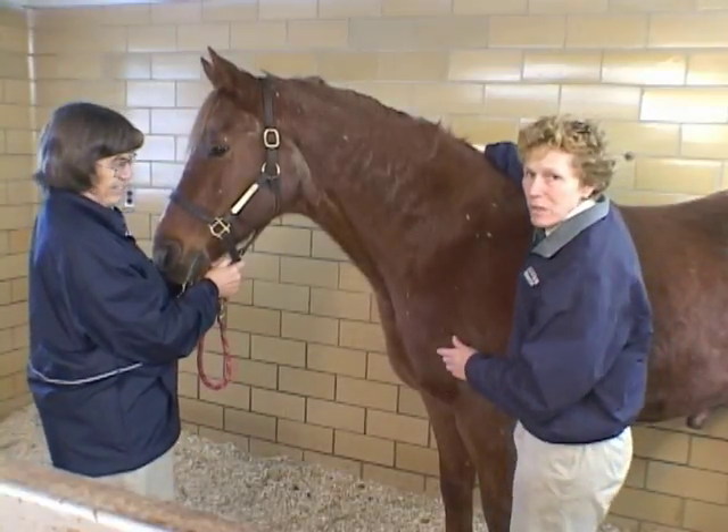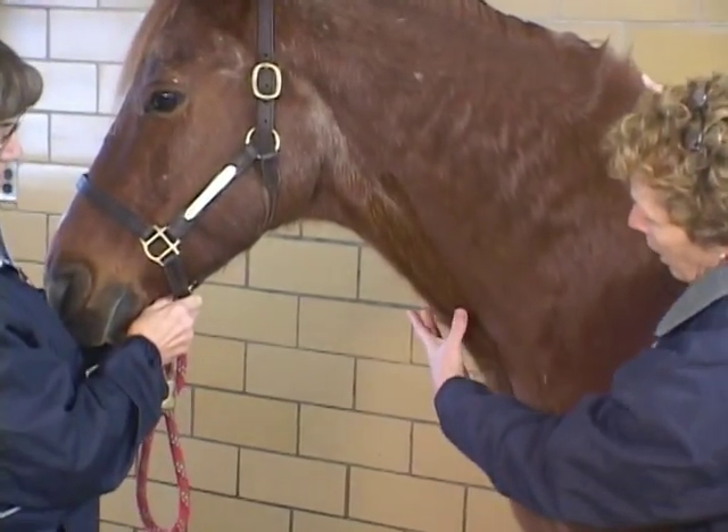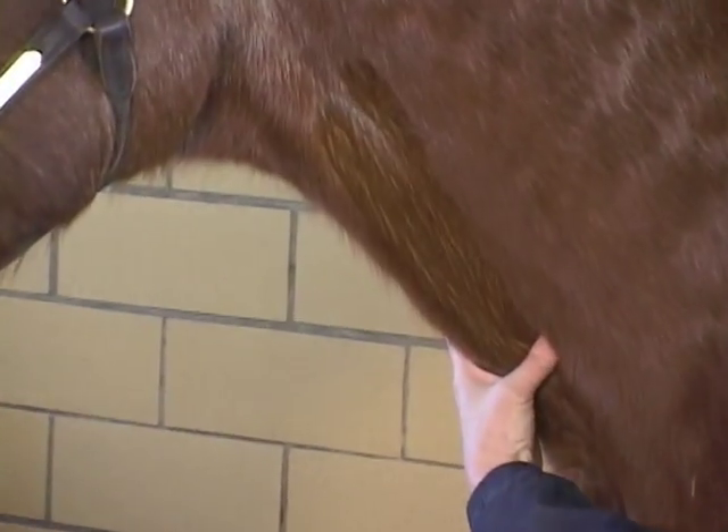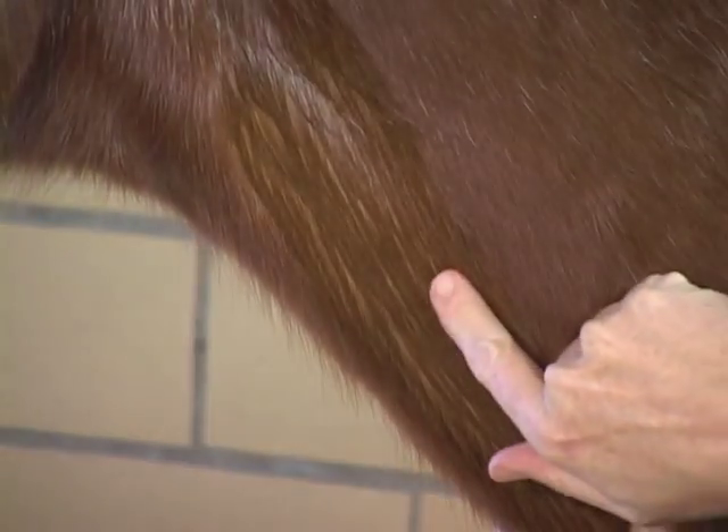We've moved Red around so you can see the unclipped side to visualize the jugular. Because he has a nice thick winter coat, we've gone ahead and put a little alcohol on his neck so that when the vein pops up, you can see it a little bit better. I'm holding it off and you can see it coming up — see the little wave as I bounce my finger on it? One of the tricks in practice is to never panic; just wait because the blood will fill the vein and you will get a good view. It's better to wait and stick where you're sure than to just randomly stick a needle into them — they start to resent that.